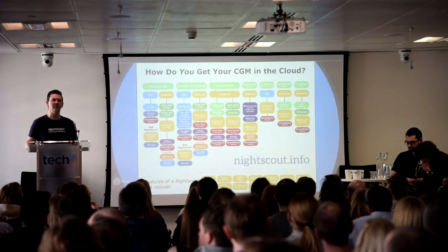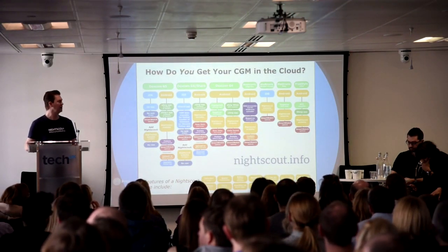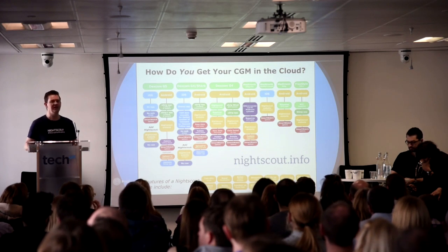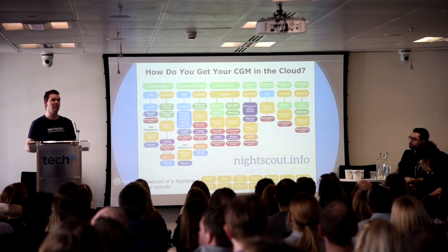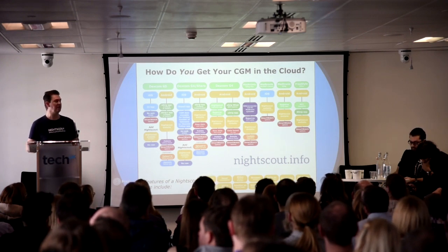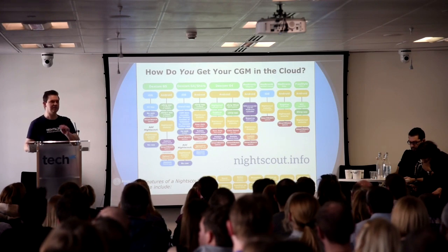There are many different ways to get your CGM in the cloud. Most of the Dexcom, the Medtronics, they're all covered. The Libre is covered as well, although strictly perhaps not within the Nightscout arena, or within the We Are Not Waiting arena. But there are multiple solutions to get your Libre turned into a CGM. Sorry, Albert.